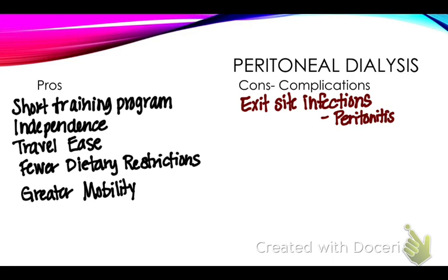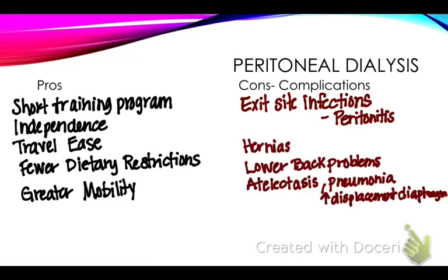Some cons is the infections, peritonitis. So you have to use meticulous aseptic technique and be trainable to do peritoneal dialysis. It depends on the support system, or the patient, the client, and how trainable can they learn this. That's a big thing with peritoneal, because you don't want them to be coming in with frequent infections if they don't understand. Some problems too are hernias, because you think all this fluid in your stomach.